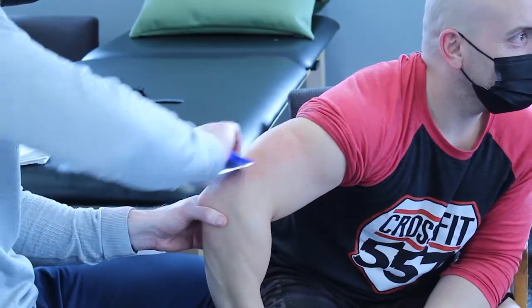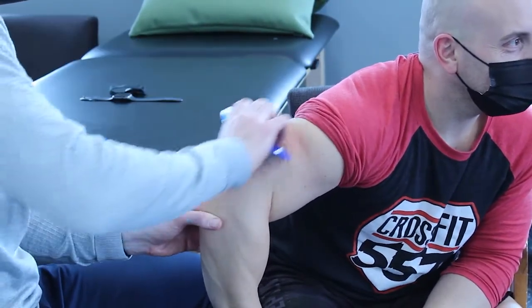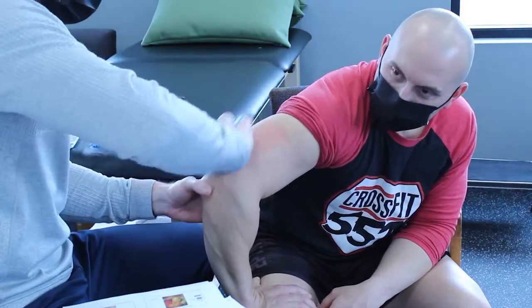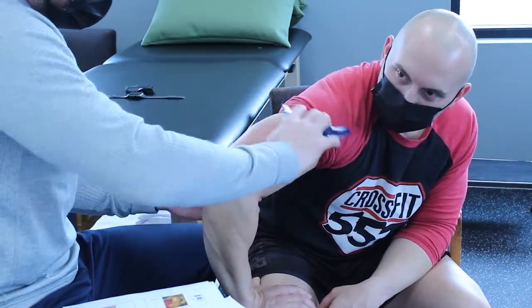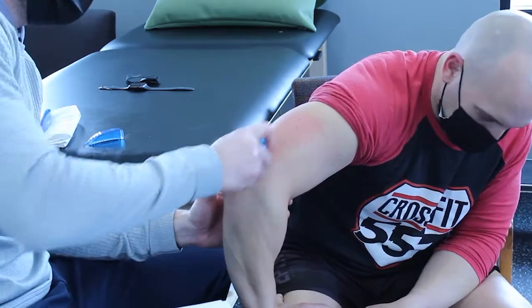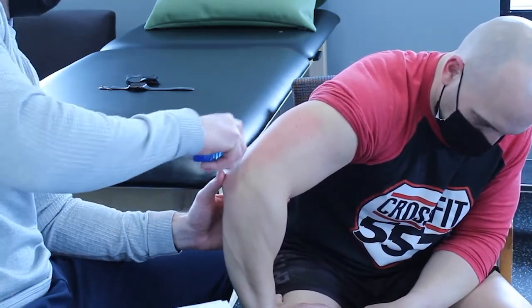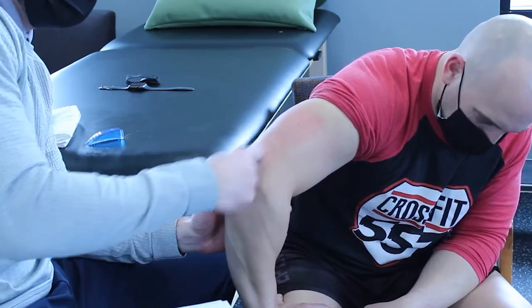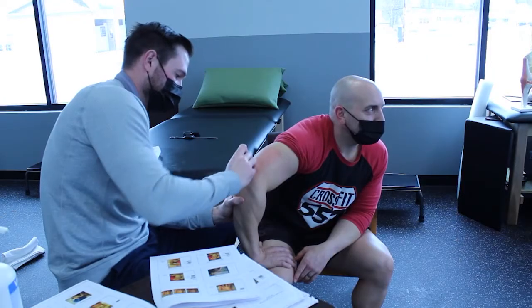Astym treatment is a common manual therapy tool used for patients with repetitive stress syndromes, especially through a tendon. Patients who work with their hands or in construction will have a lot of repetitive stress around the elbow.